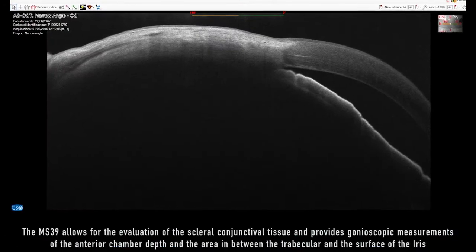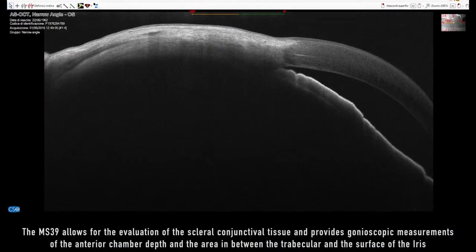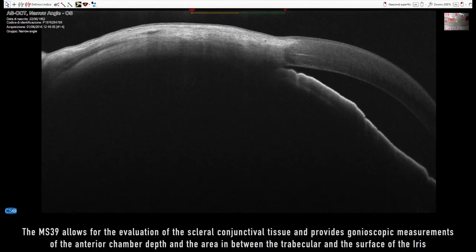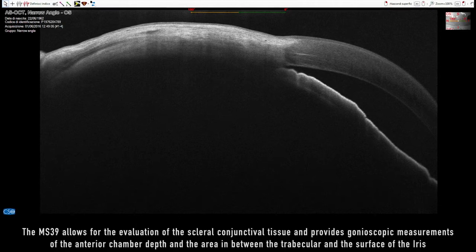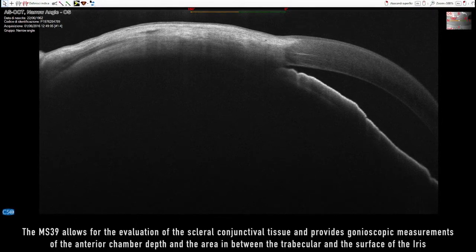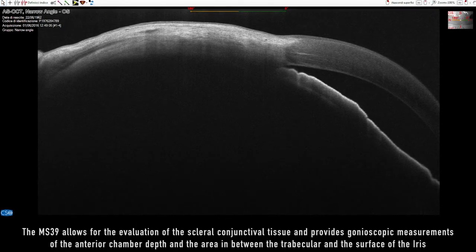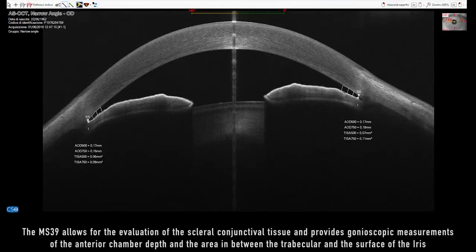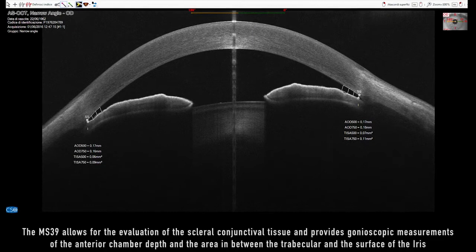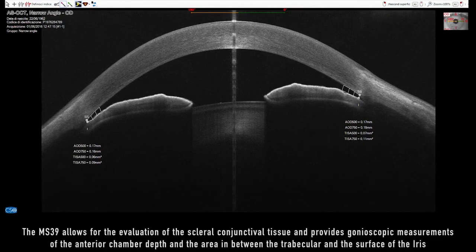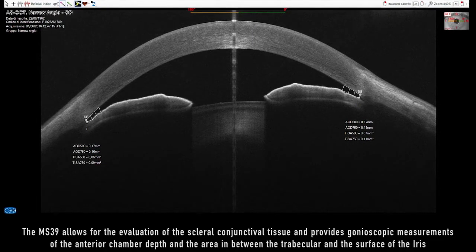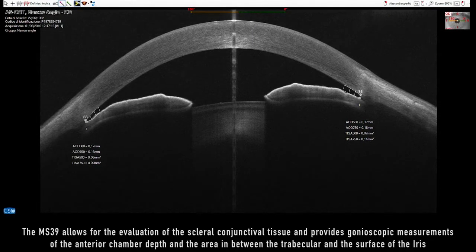The MS-39 allows for the evaluation of the sclero-conjunctival tissue and provides gonioscopic measurements of the anterior chamber depth and the area in between the trabecular and the surface of the iris.